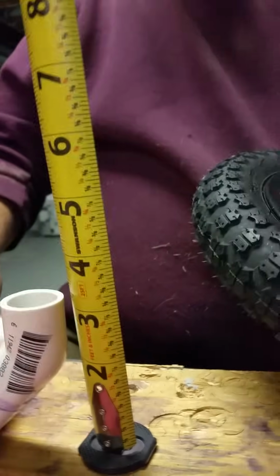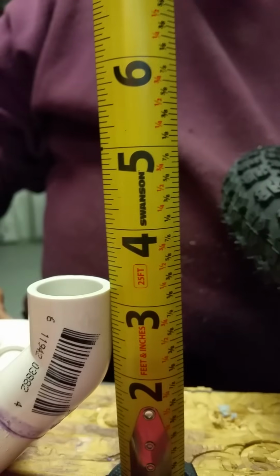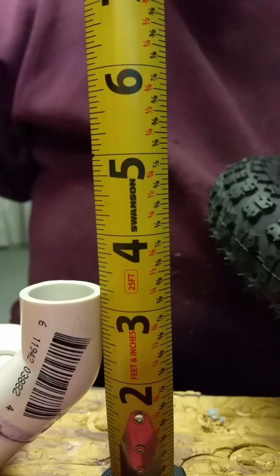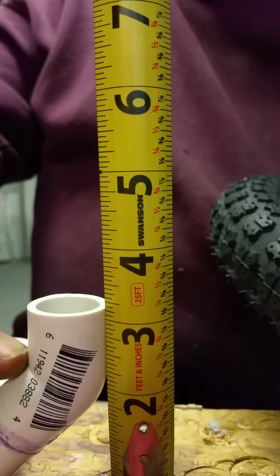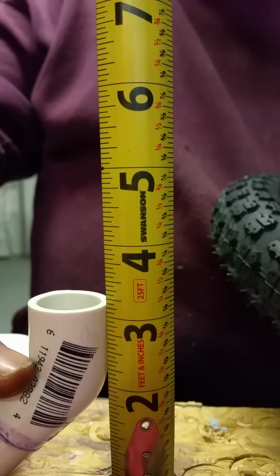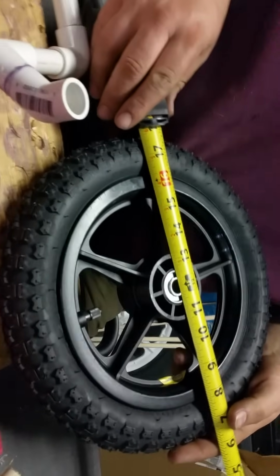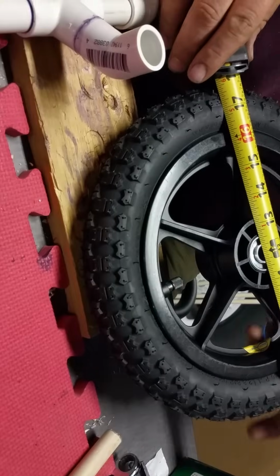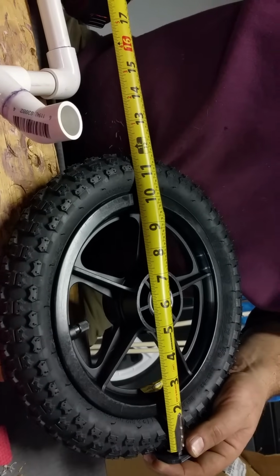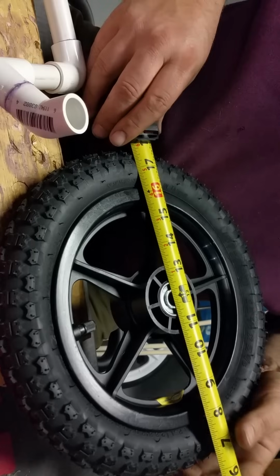This height right here, it's hard to tell from my angle. But if we're measuring the usable length, we're at 2.5. So we've got 2.5 inches of height already built into the cart. This particular cart height is 18 inches, and we have a 12-inch wheel that we're using.